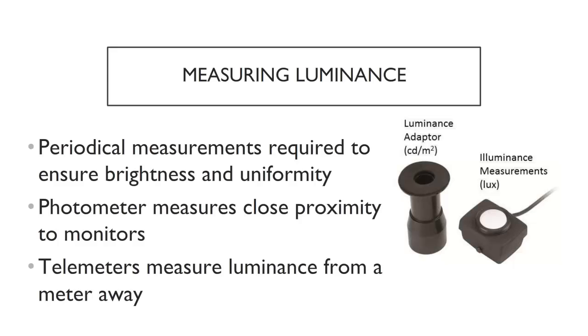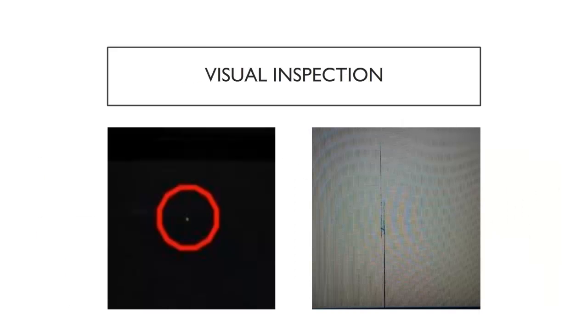There are many tests that the radiologist can perform just by viewing the monitor and looking for issues. LCD monitors can have dead pixels. One dead pixel will look like a white dot when the screen is black. A diagnostic monitor that has more than 15 dead pixels across the entire monitor must be replaced.